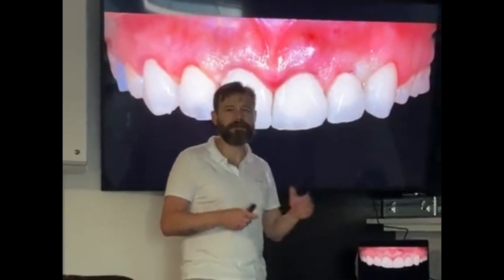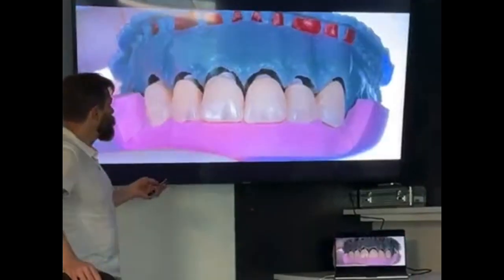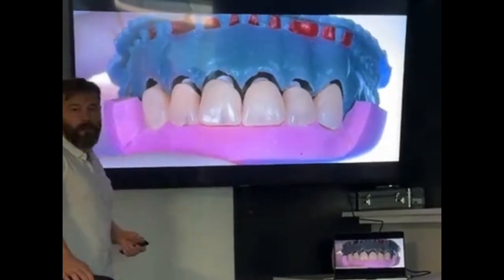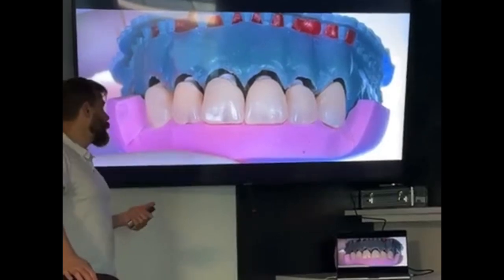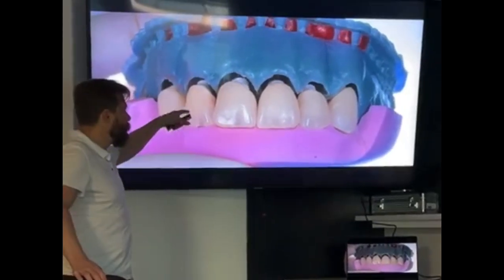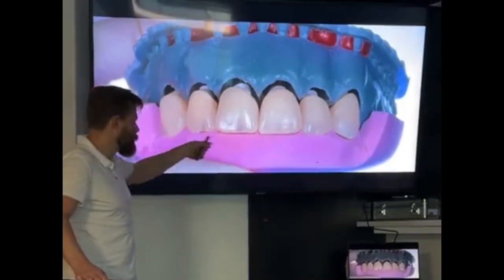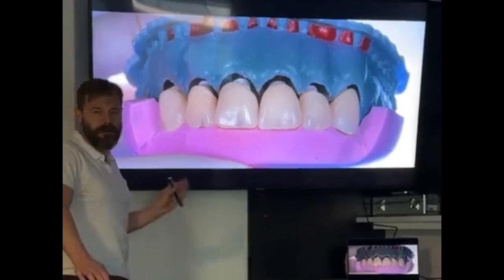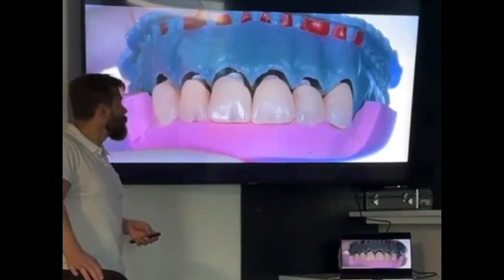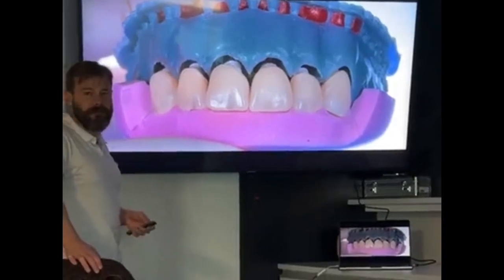How did you create the model? Here was a scanning. We scanned this model to create the provisionals. So this helped to position the provisional and realign it, because we even have the guide of silicone. So you scanned inside the surgery and printed the model? No, this was pre-done. Pre-done? Okay. Yes, okay.